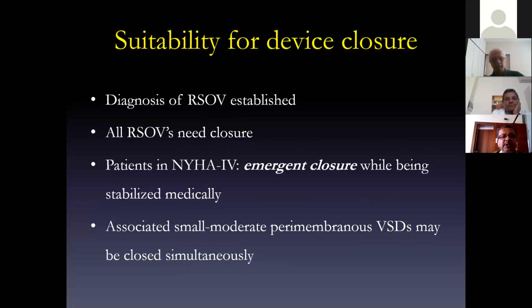The suitability for the device closure. The diagnosis of the RSOV is established by various methods like the clinical diagnosis as well as the echocardiographic diagnosis. But please remember, all RSOVs need closure. Even if it is a small one, I think one day the rupture is going to increase in size. It is going to cause hemodynamic problems. So even if it's a small, tiny rupture, they need to be closed. And it is not very difficult to close.